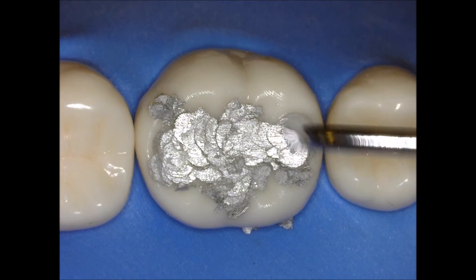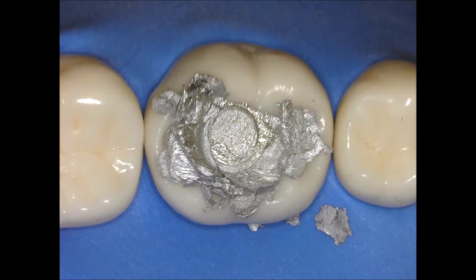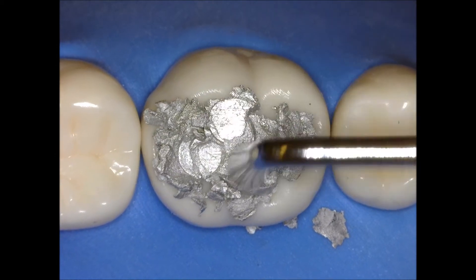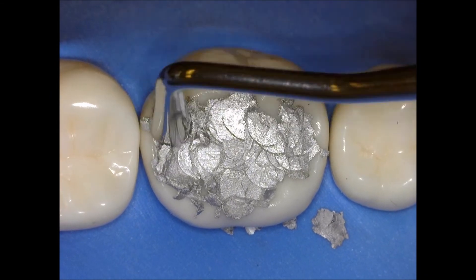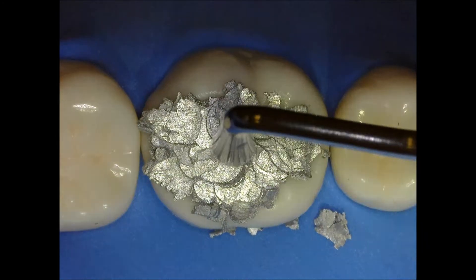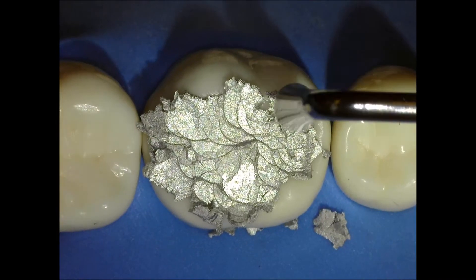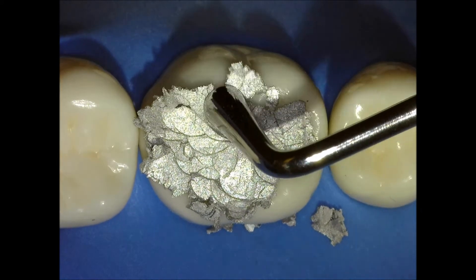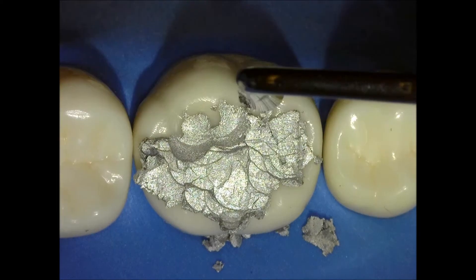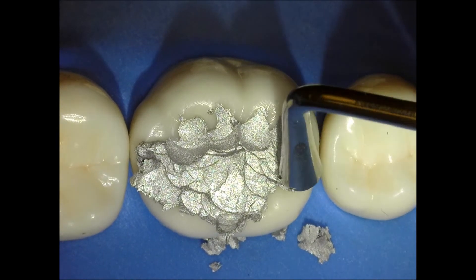I'm going to be placing a little bit more amalgam. Remember, amalgam has to be overfilled always because we're going to be condensing. Every time you condense, you're releasing some of the mercury on top, and that mercury needs to be removed when you carve. So you want to make sure that you have a lot of amalgam in there to cover all the cavosurface margin as well. I'm using the condenser following the anatomy of the triangular ridges just to remove some of the gross excess.